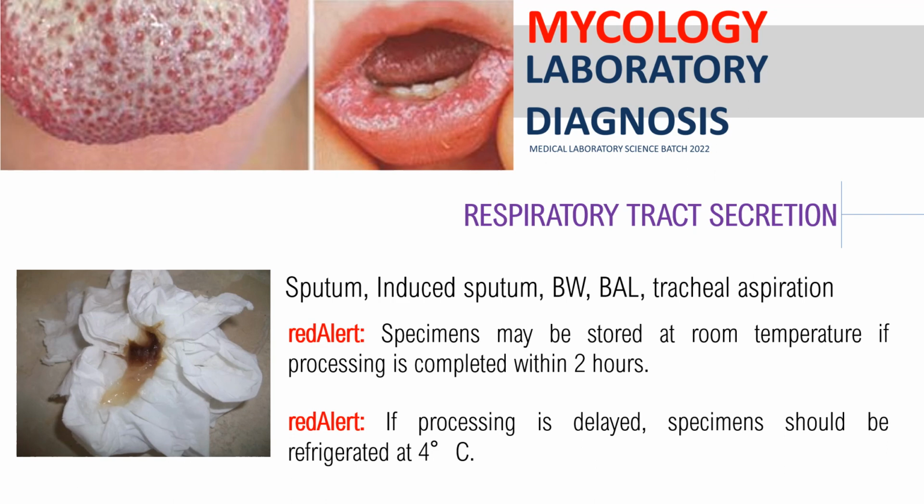So, take note with this one, class, ha, kasi as a medical technologist, if you will process your sample beyond 2 hours, the integrity of your sample will be compromised. So, anong ibig sabihin ng compromise? Mako-compromise yung sample. Ang ibig sabihin ng class, that the sample, okay, either the sample contains bacteria and the bacteria will, what class? Try to multiply. And this contaminant class can actually hinder the replication of your fungi. Kaya pag nag-culture ka, what will happen? Pag nag-culture ka class, it will cause a negative result.